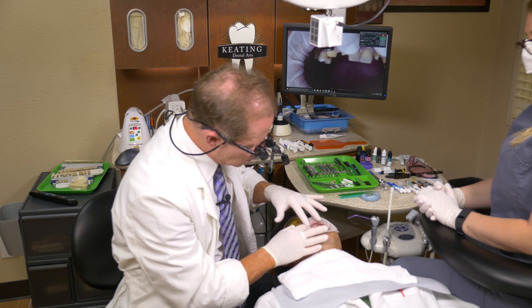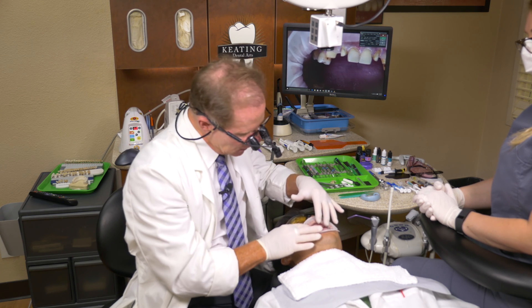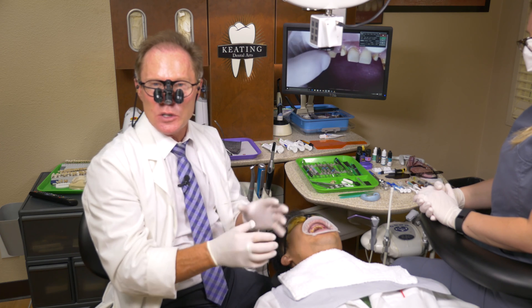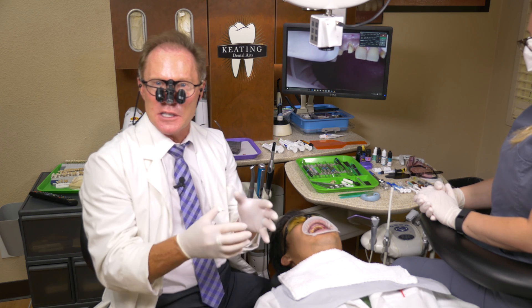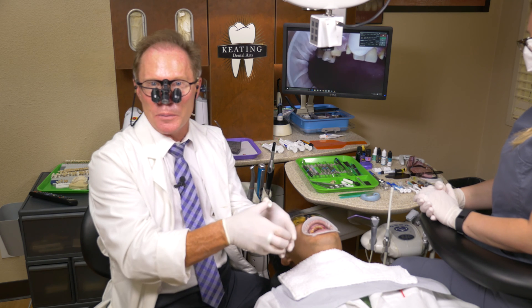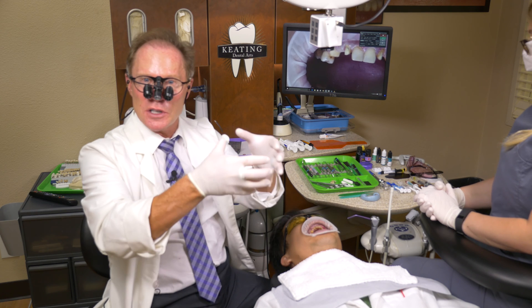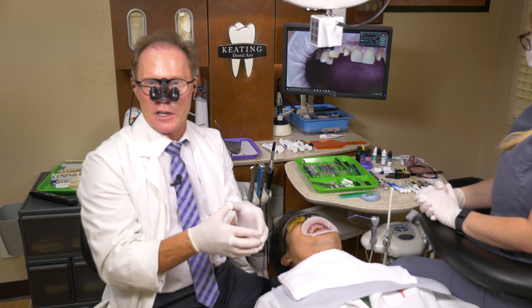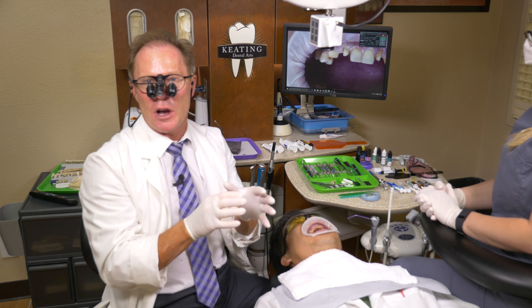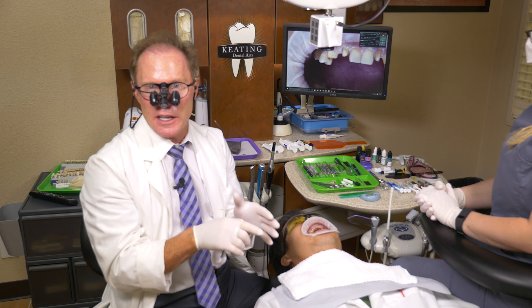So we're going to actually create what we call an ovate pontic site, and then the laboratory will create a pontic that fits into this site. We're creating with the pontic itself not only the coronal aspect of the tooth, but also part of the root form. The nice thing about this pontic is it'll look very natural because it'll look like it's growing out of the tissue like a natural tooth. Also, it's all positive or convex contours — like an egg — so it's very cleansable for him.